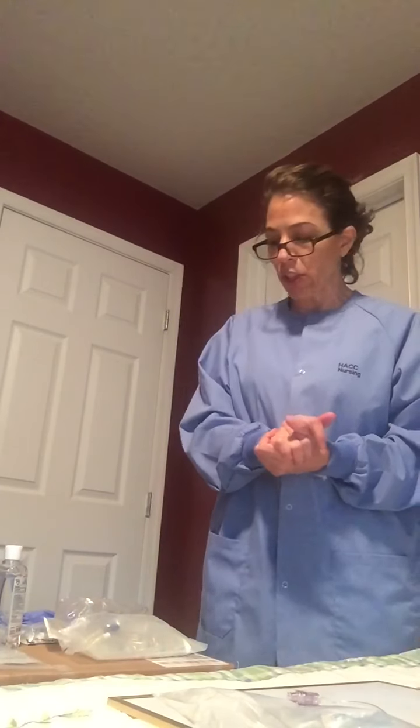I would also look for phlebitis, which is an inflammation of the vein itself. So I would look on the hand and along the length of the vein to see if it's protruding a little bit more. There may be redness, warmth, some pain, but this site looks good.